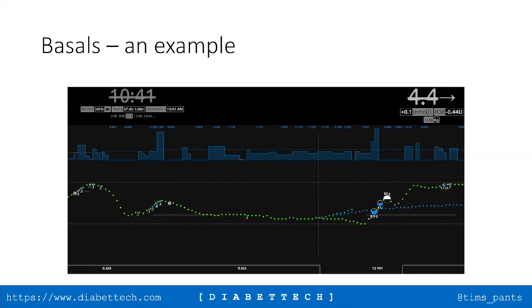Looks too low to me because there appear to be a lot of SMBs going on there. So the algorithm's thinking there's not enough insulin on board to keep the level at target. So what are you saying about the basal rate at the point in time we're talking? Where that line is. What we're looking at is from that line back over these 3 hours or so. Yeah, I would say it's too low. It looks like the loop's trying to reduce the amount of background insulin, so I'd say it's too high, isn't it? So what are the key things to look at in this graph?